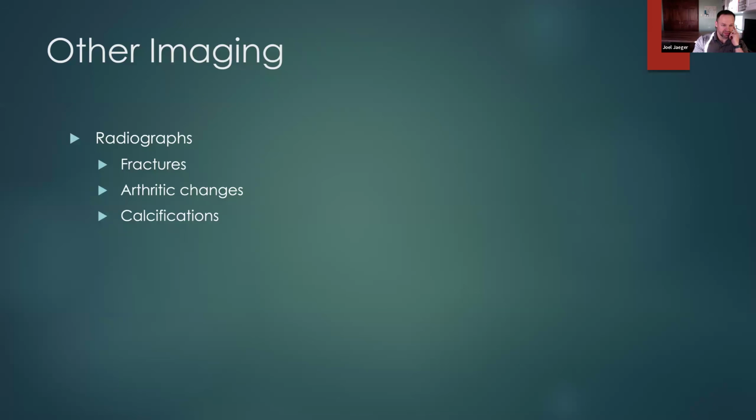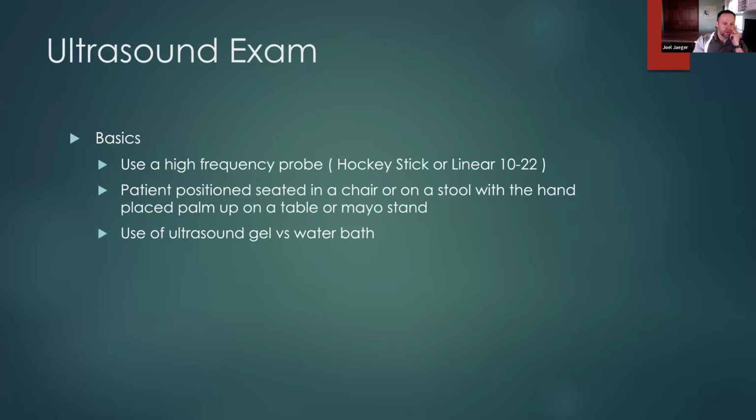with doing diagnostic ultrasounds. So she's coming in. We're going to do an ultrasound diagnostic and take a look at her hand. And the expectation is we're probably going to be leading to an injection. She was pretty clear that was her goal for this visit.